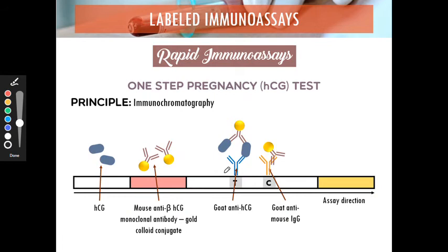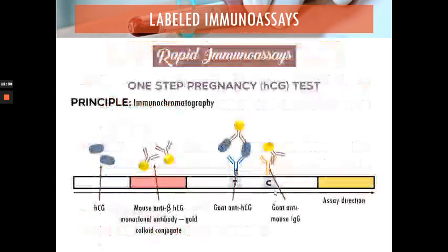Okay? Alright. And of course, the excess reactants that were not captured by your antibody waiting in your detection zone, the test and control lines, will then be absorbed by your absorbent pad. Okay? So I hope you get it.